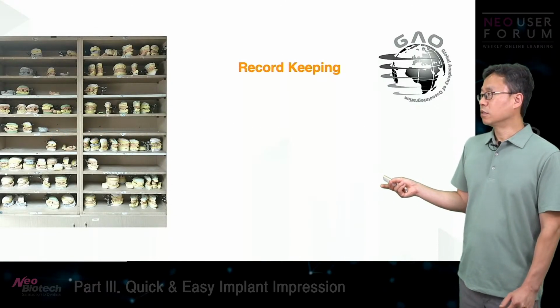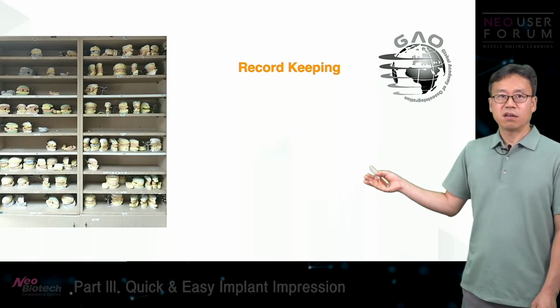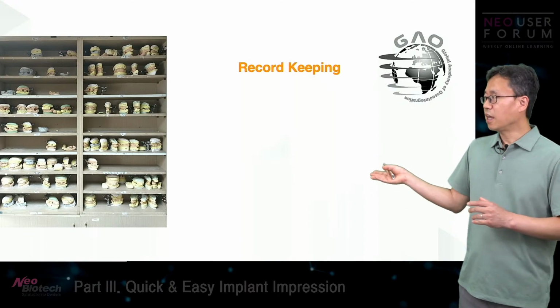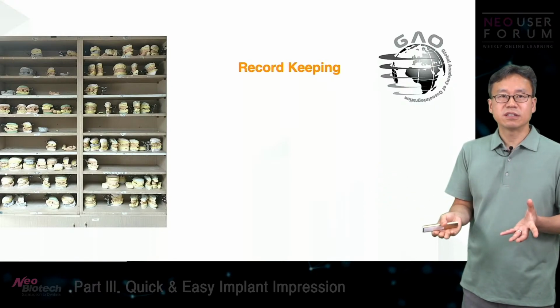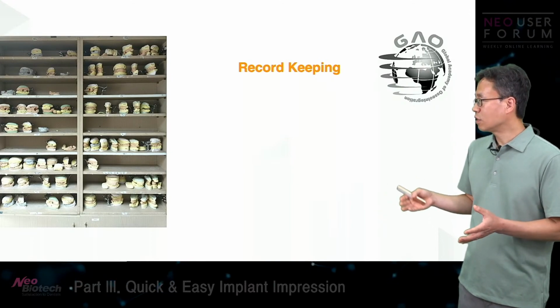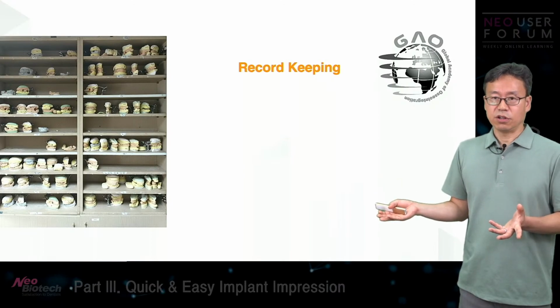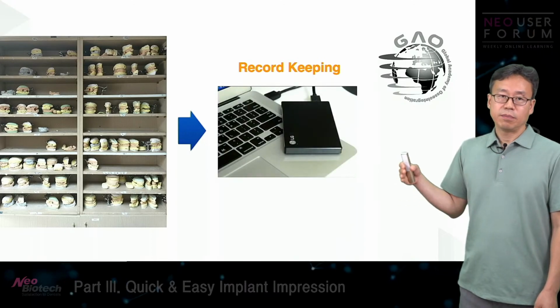We all know digital data, such as scanning data or CAD design data for prostheses, are very easy to store in a tiny memory device like this, compared to conventional dental work where we have to make models and sometimes keep them for a certain period of time until the treatment gets finished, just in case, you know. They can be quite a pain in the neck, isn't it?